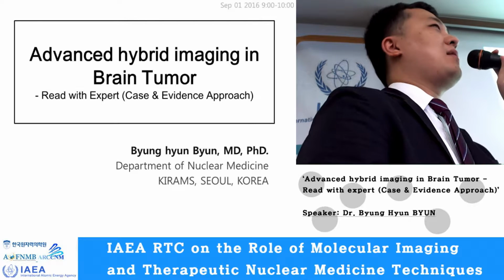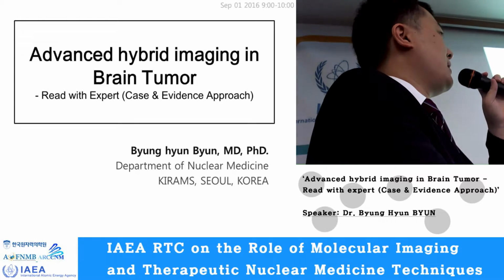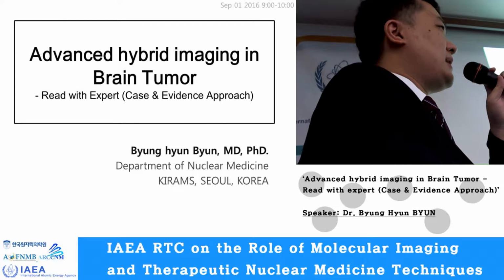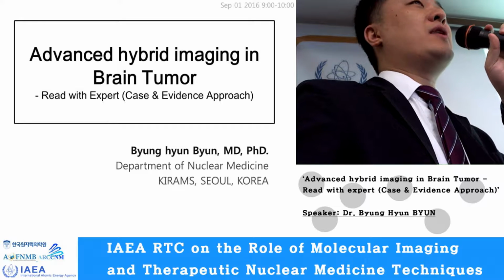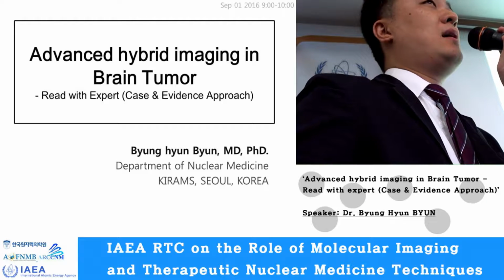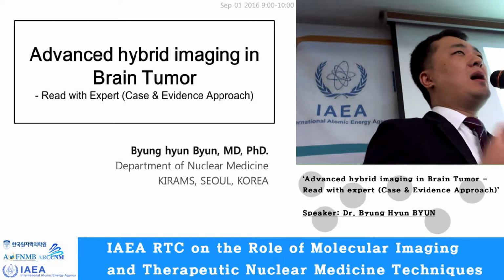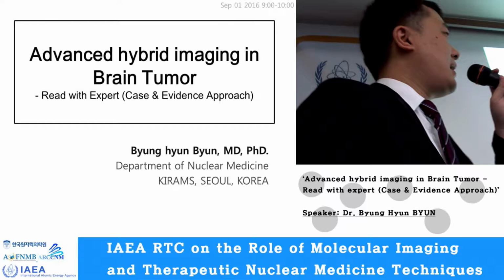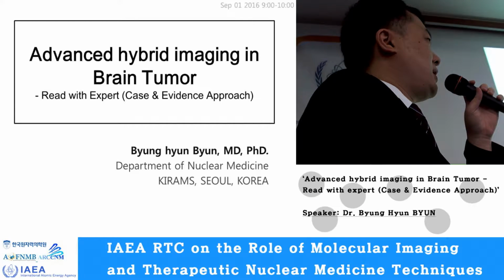Physician. Today my talk is actually in two parts. The first is about brain tumors, and the second part is multi-parametric imaging, for example, PET/MRI images in oncology. I will start with the first part, brain tumor.